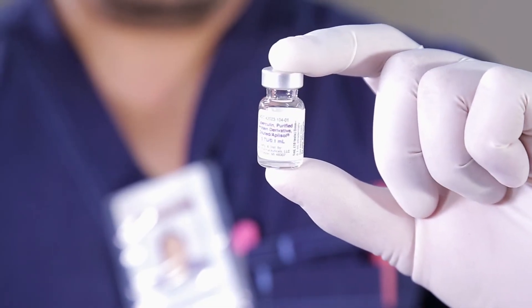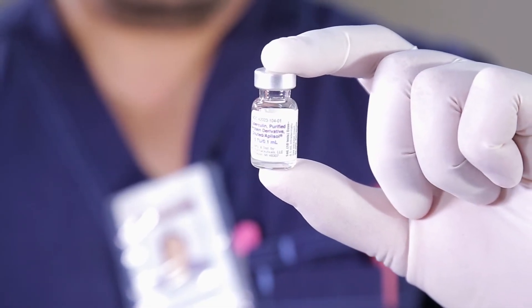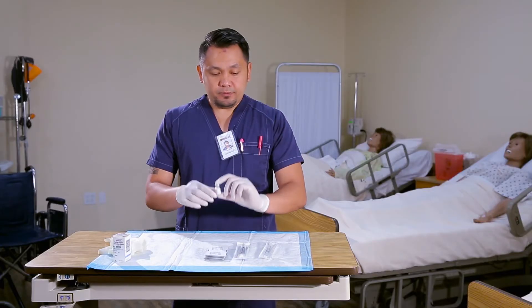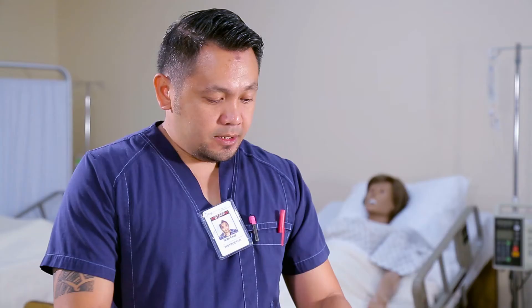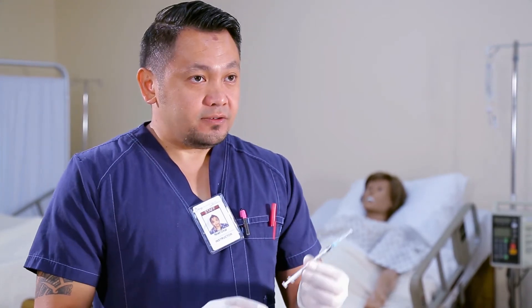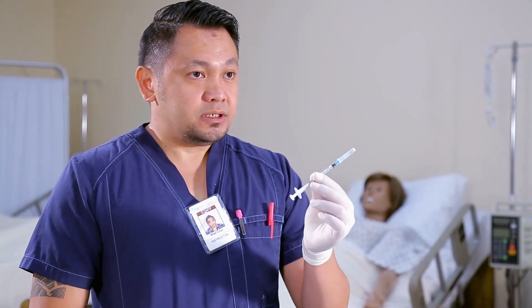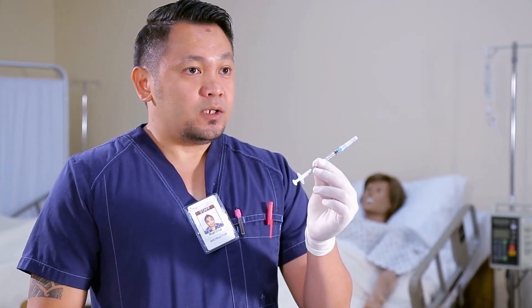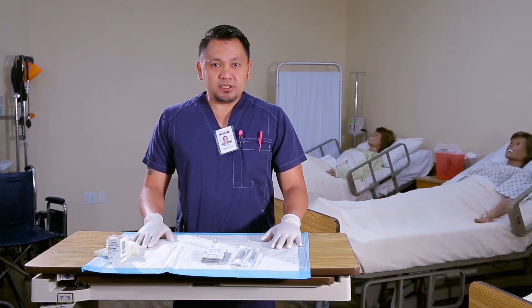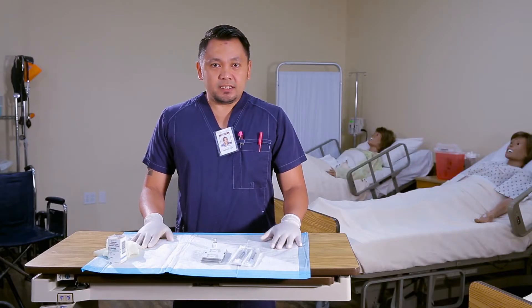Check the expiration date on the medication vial. Assess the integrity of our needle and syringe, selecting a 1 ml tuberculin syringe.